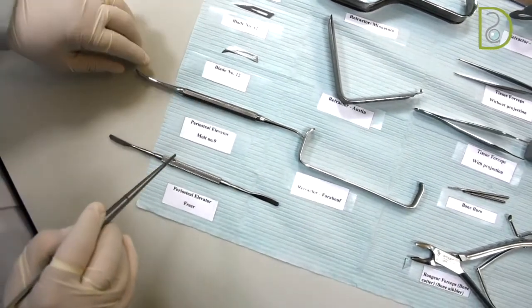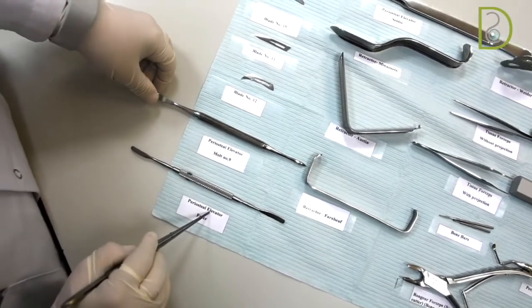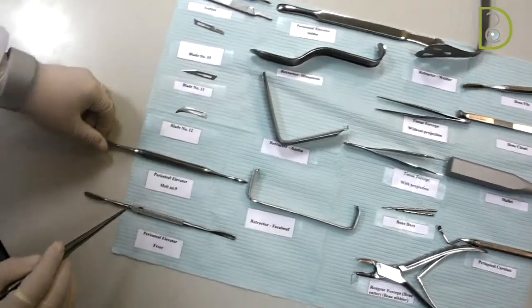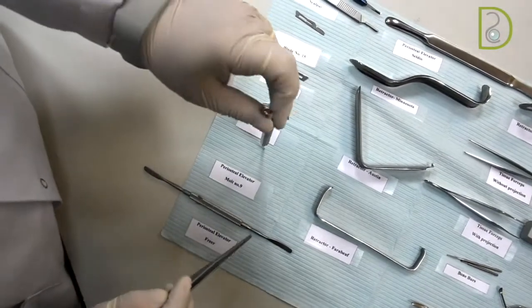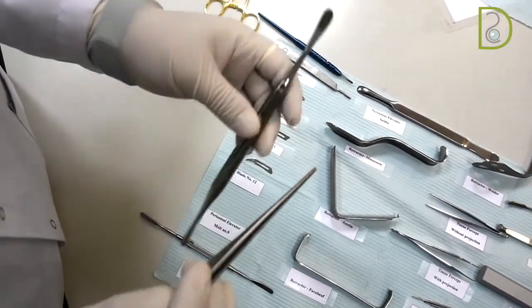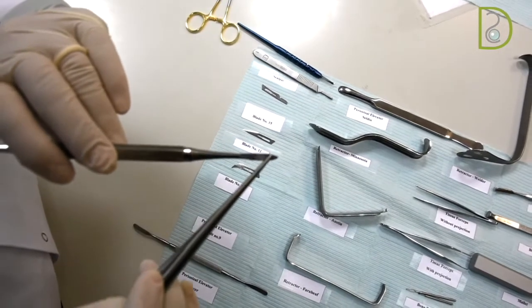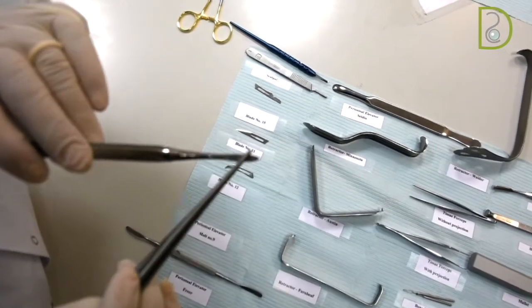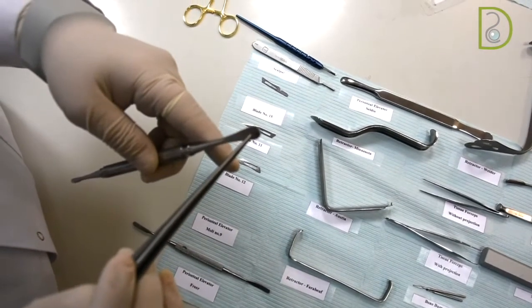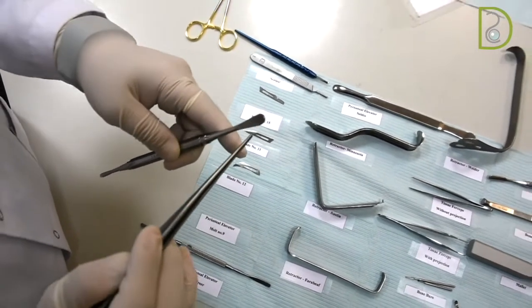Now we will move our explanation on to the elevators. And we have three different designs. This is the most used one, the Molt number 9. It has a spoon shape and a pointy shape on the other edge. This pointy one is to reflect the dental papilla, while the spoon shape is to reflect the mucoperiosteum from the bone.